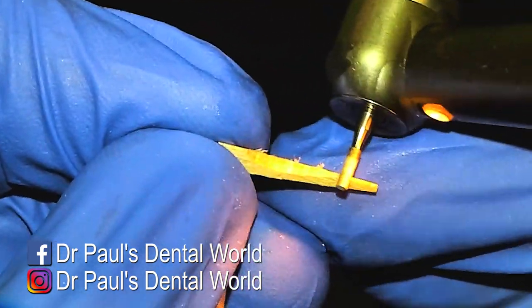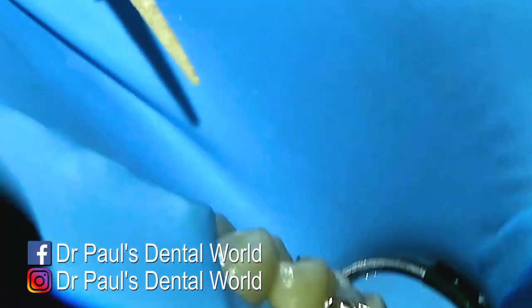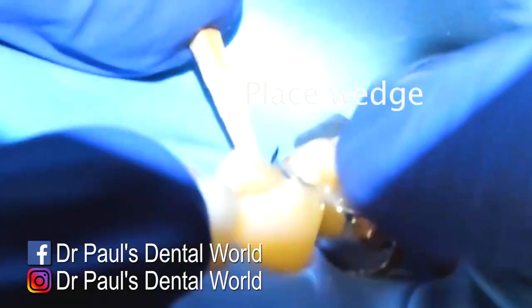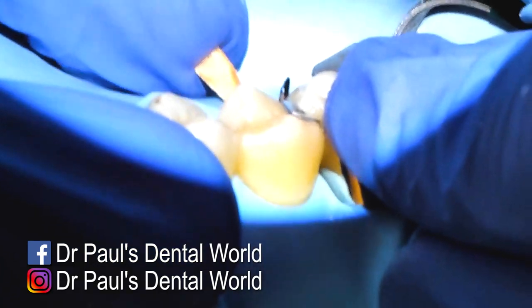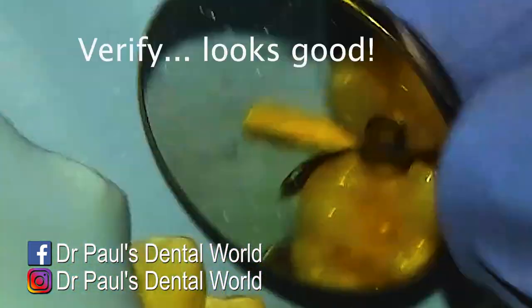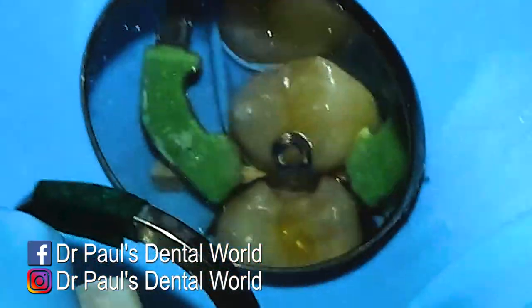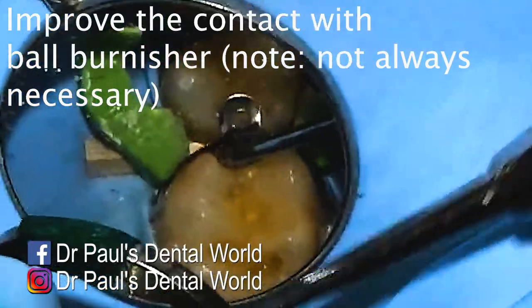I want the matrix to have a nice gentle curve. If the wedge is a bit too high it will actually deform it, so often I'll chop off the top half. I'll line it up and put my finger in just to make sure the matrix doesn't move as I push the wedge into place. Then I'll verify from above — we've got really good adaptation. My V-ring will go in place, and I'll use my burnisher to get a nice tight contact with the tooth in front.